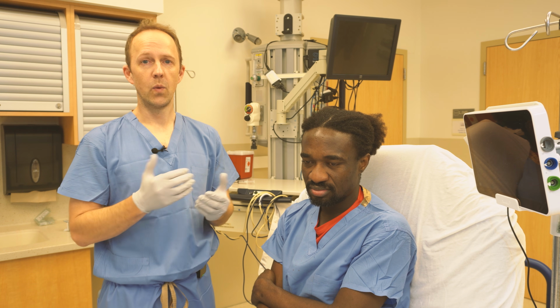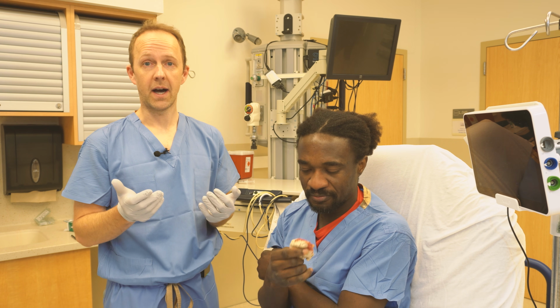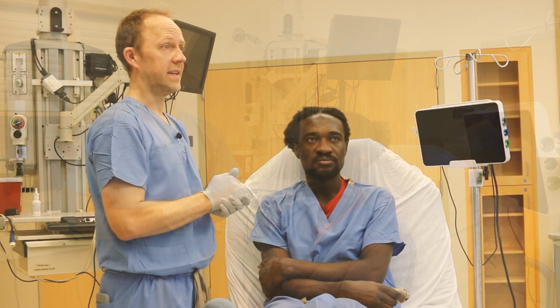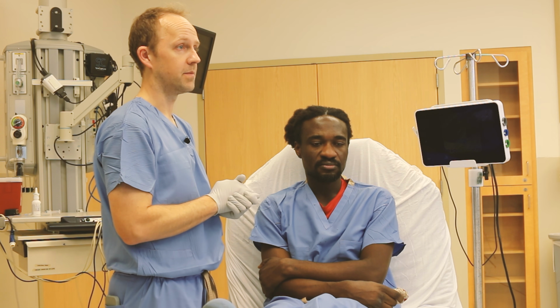When you're deciding which endoscope to pass through, since we're using a 6.0 tube, you really want to use the smallest endoscope possible. We prefer something with a 3.8 millimeter outer diameter. Even that still requires some lubrication to get through, so you're going to have a much easier time using the scope when you use a smaller endoscope.